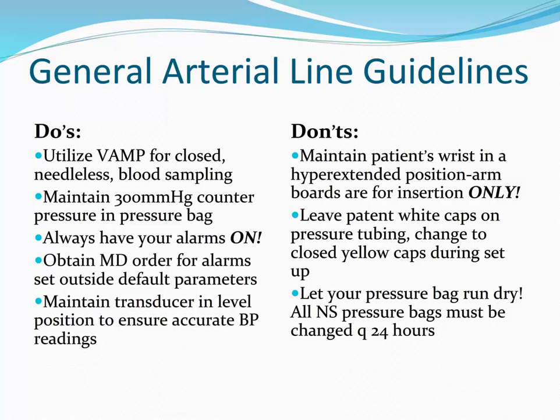If these scenarios are not corrected immediately, you could lose the line, not be aware of hemodynamic changes. In the worst case scenario, not be aware that your patient is hemorrhaging from a disconnected line. There is never a circumstance when you are allowed to shut this alarm off. If the tracings are dampened or pressures are inaccurate, but you still need the line for phlebotomy, adjust your alarm settings, but don't shut off the alarm.